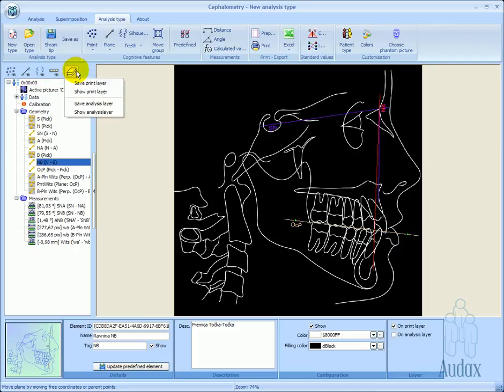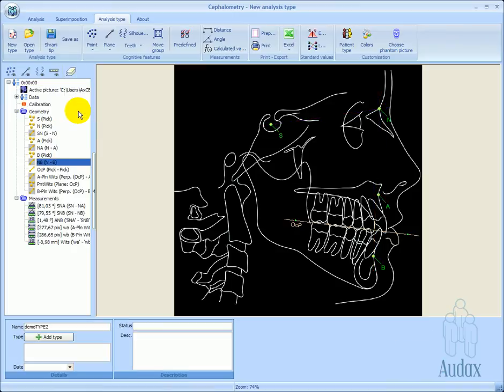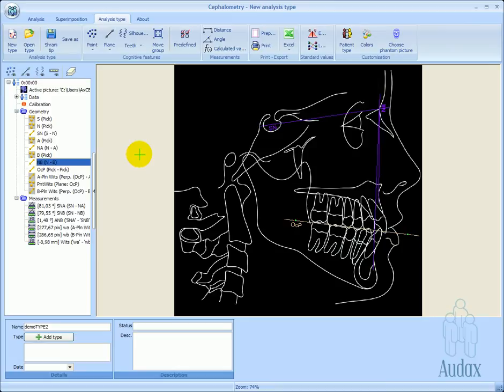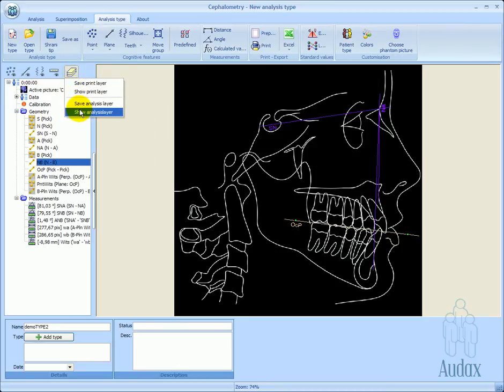When complete, the current view is saved to the print layer. As demonstrated, the analysis is defined on the two layers. The first layer is used for the analysis construction, and the second one is used to print the analysis or to export it to a spreadsheet application.